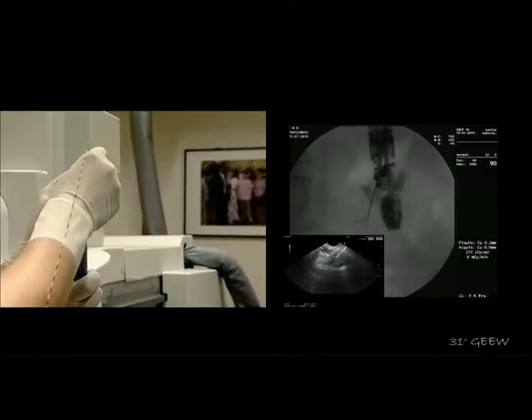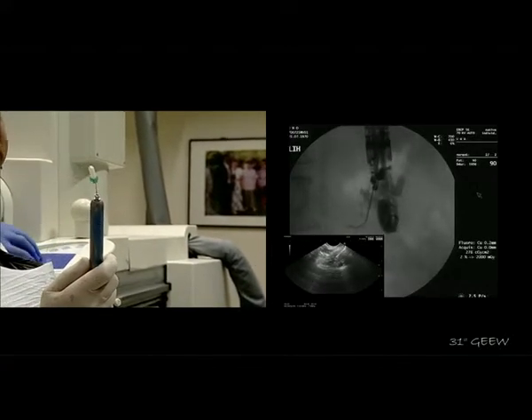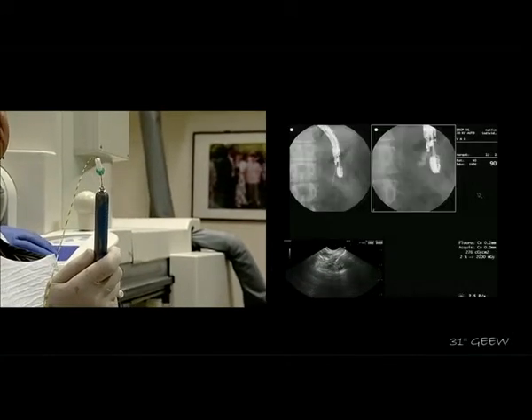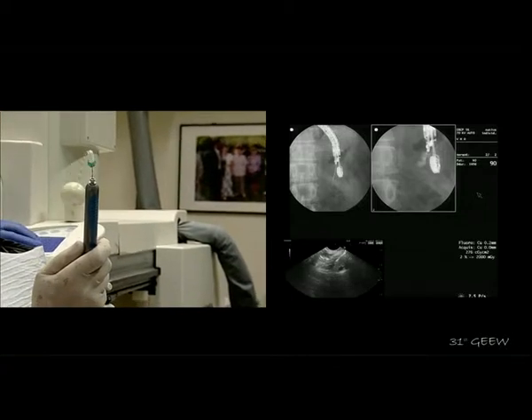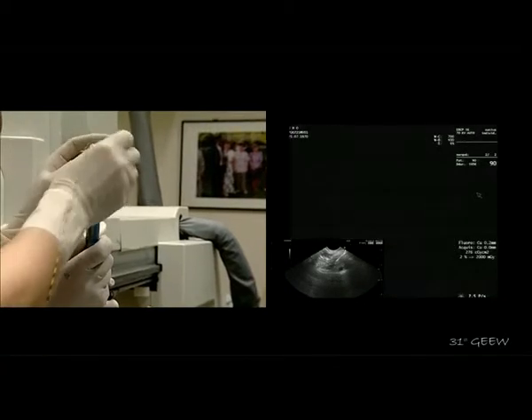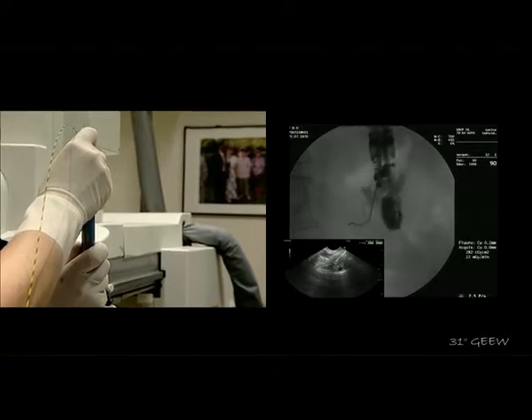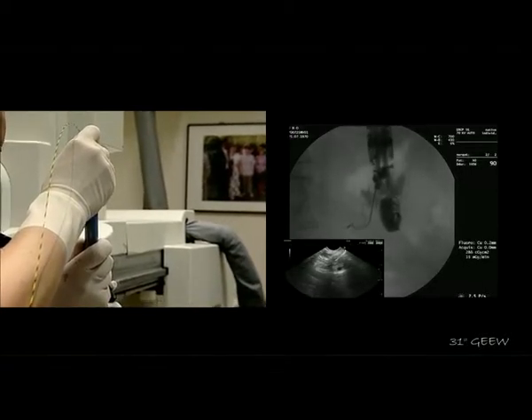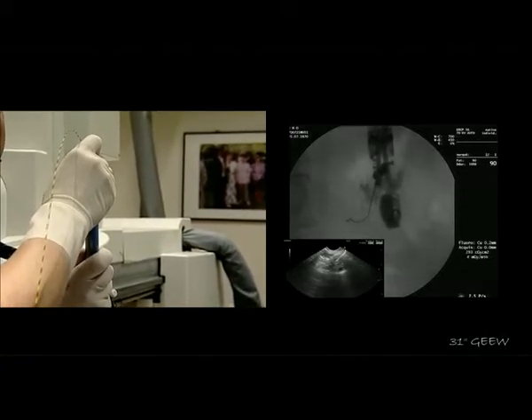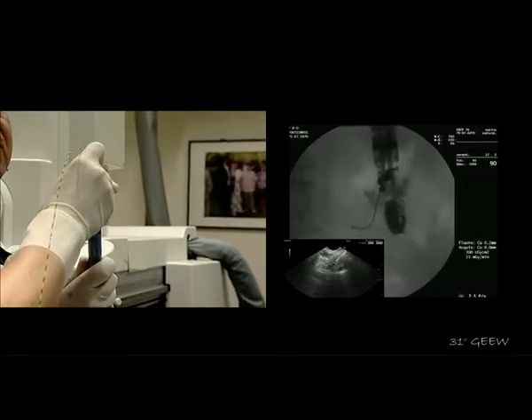Ah, yeah, this is much better. This is the stenosis. This is the stenosis. So we will just double check the picture there. You see that it is always important to keep the initial injection image. So we might be in the pancreatic duct there, but the problem is that we should come back inside the duct. I'm too close to the stenosis, probably.